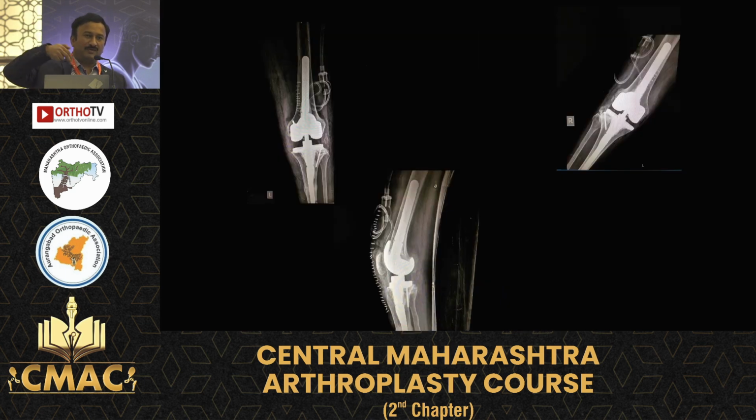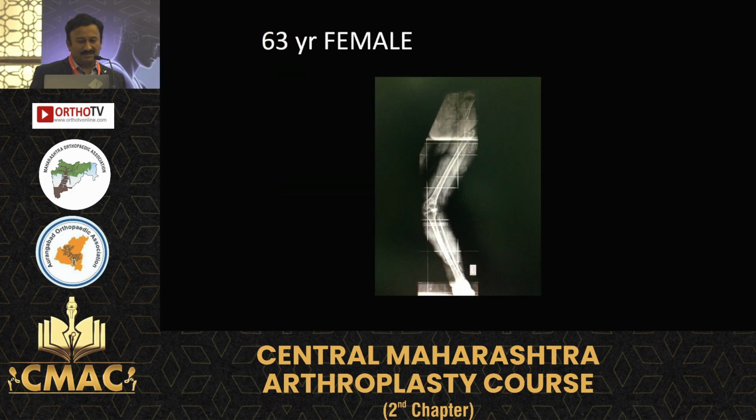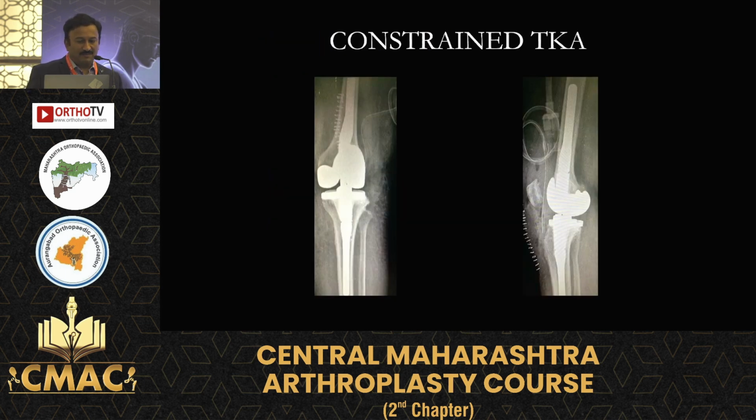You can do the bone grafting on the lateral side. You can see that there are 2 screws there. Bone grafting is done, and the balance is very good. So same thing, bilateral valgus, severe valgus case, HKA axis completely gone inside and managed with the constrained knee. So here you don't need to think about that.